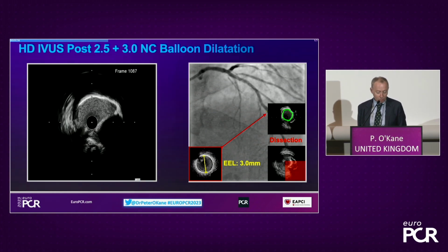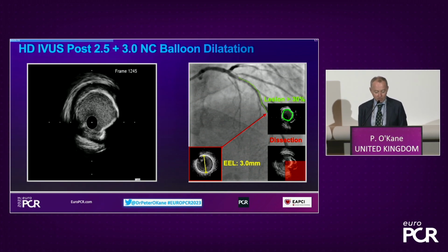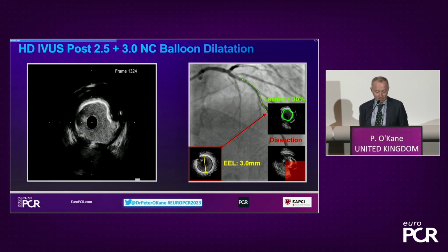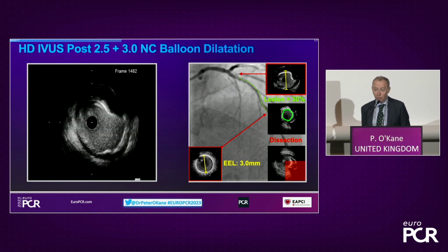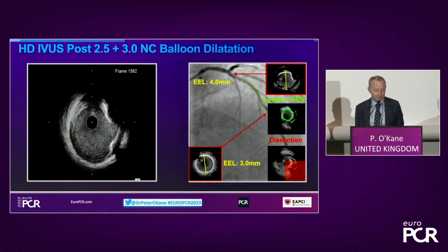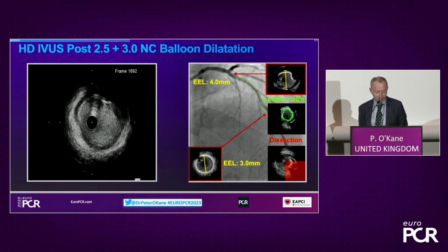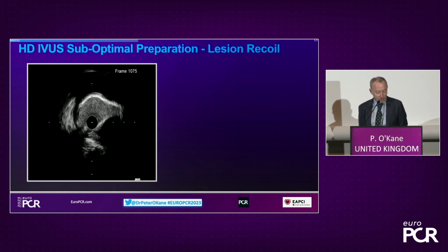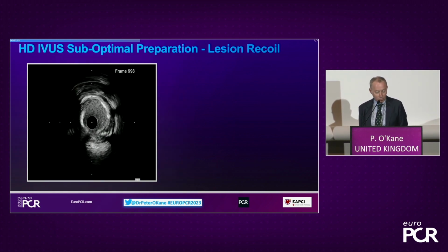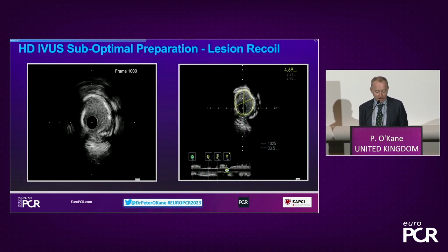But then you come into this more proximal segment where there is still quite a significant residual stenosis, which fits with what I saw on the angiogram, and it's still, I think, more than 30%. And of course, often on the imaging, the stenosis will be more than 30%, so you have to take that with a pinch of salt. And then the proximal vessel is quite large, so there's quite a big size difference, which is interesting if you're considering a stent in these cases. So when we go back and focus on the area where it's most suboptimal, where there is more recoil, again, we can get a very quantitative assessment, and the CSA is around 4.7.